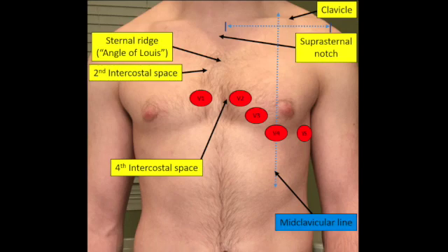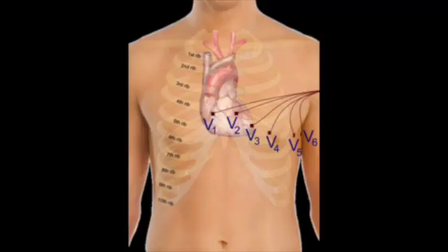Does that make sense? No. So go to a little bit more detail. Okay, so it's not like we put these on the stomach. We don't put them up higher. We put them across, exactly. We kind of follow the typical axis of a heart here. And so we can tell a lot about the placement of a heart and what the heart's doing because these are placed there. So let's say these are detectors. Don't even think of them as leads. They're like little detectors.